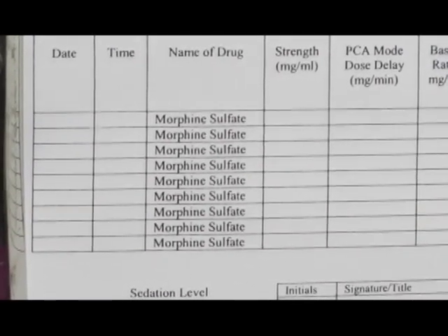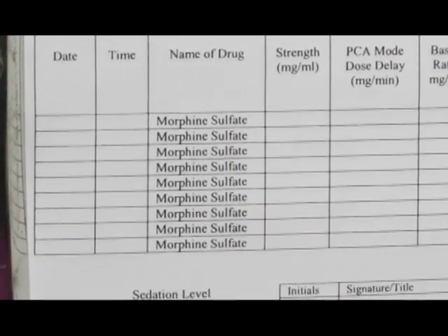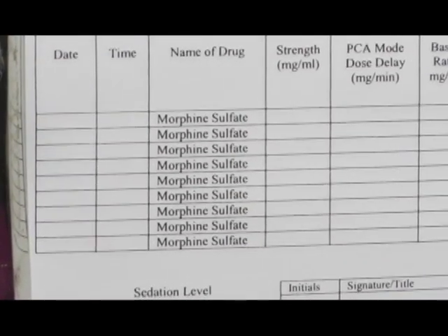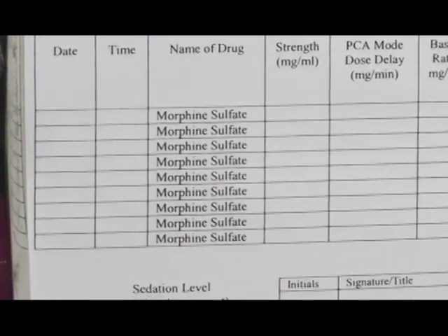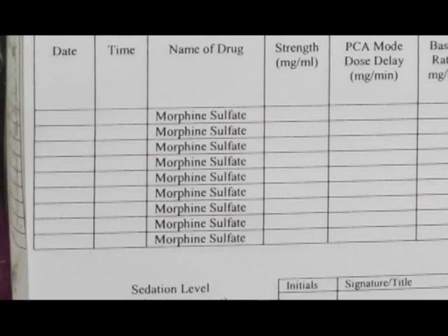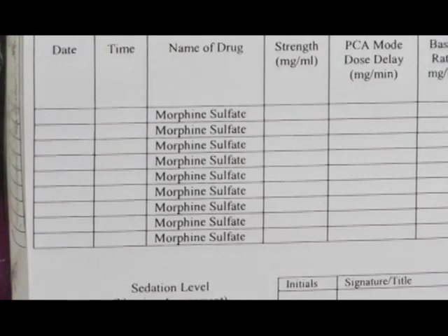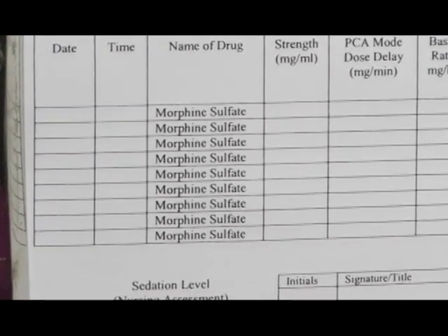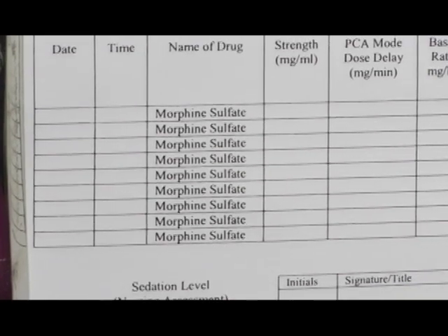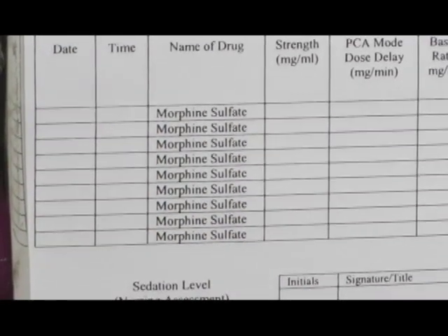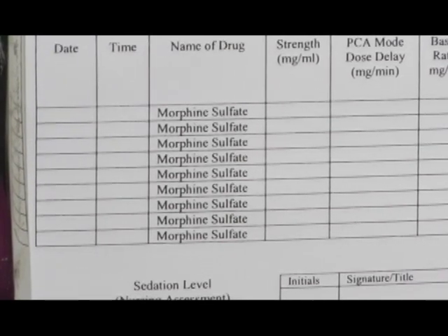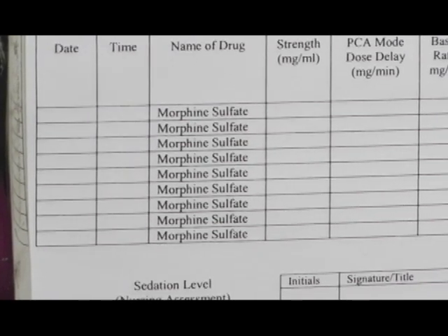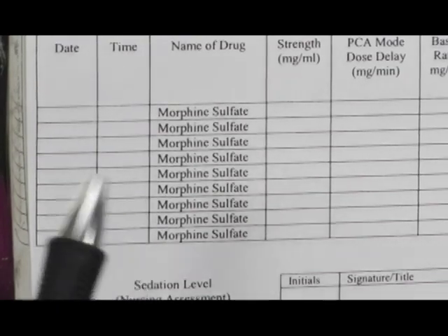The first step is to initiate the PCA record for documentation. To do this, you'll need the help of a second licensed nurse. I've positioned the PCA record here so that you can see how it looks. As you're doing this procedure, one of you will be filling out this form while watching the values on the pump, and the other nurse will be actually scrolling through the pump to find the information. So it's a process that involves two people.